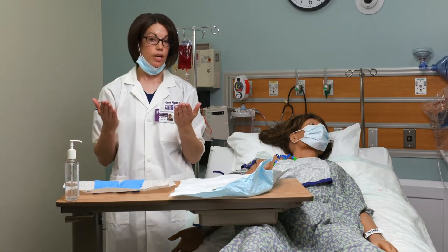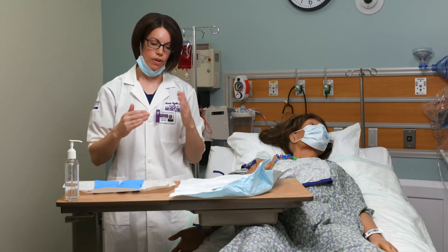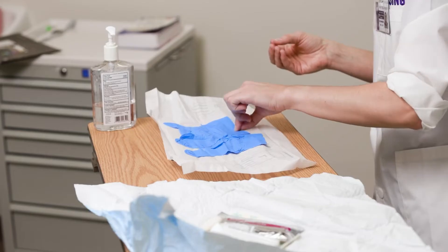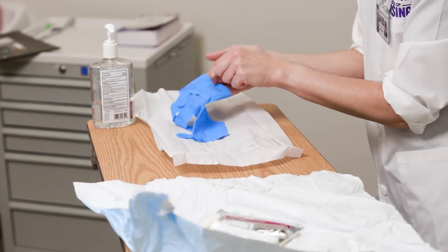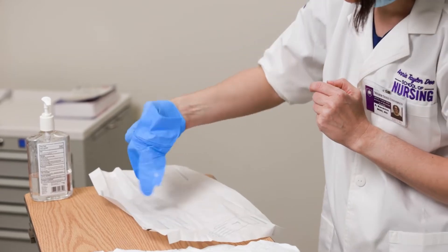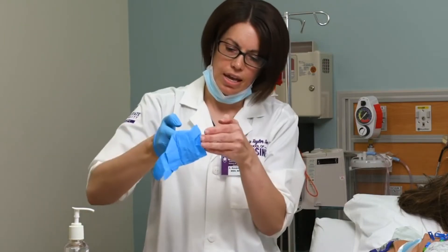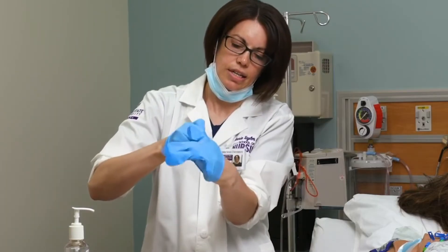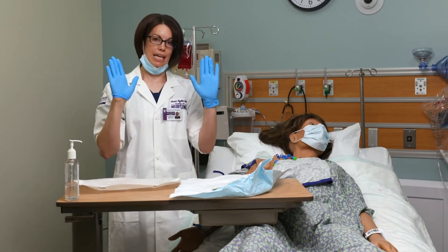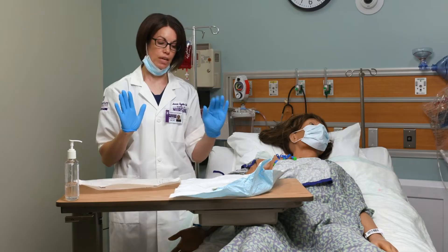When placing my gloves on, I have to make sure I do it sterilely. If for any reason I contaminate my sterile field, I need to start again — same with pass-offs. I'm going to pick up my cuff and slide on my sterile glove, then use my sterile gloved right hand inside the cuff to don the other glove. Once I've got them on I can adjust. Now that my hands are sterile I need to maintain them above my waist and not drop my sterile gloves below my waist or my sterile field.